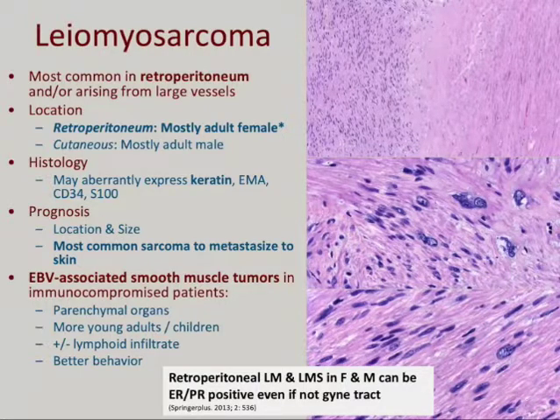If you have a tumor that doesn't look like the nice leiomyosarcoma morphology and really only has a little bit of SMA, what cell is that recapitulating? That's maybe trying to recapitulate more of a myofibroblastic-like morphology than a true smooth muscle. So just remember, wispy cytoplasm, nondescript, a little SMA, myofibroblast. Eosinophilic cytoplasm, 90-degree intersecting angles, cigar-shaped nuclei, think leio, okay?